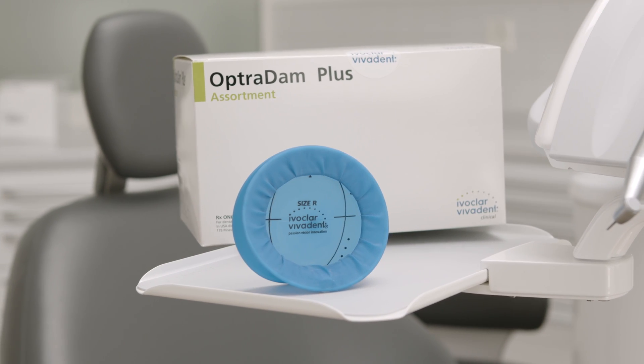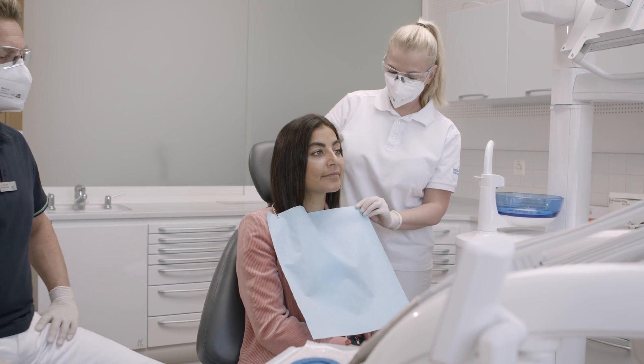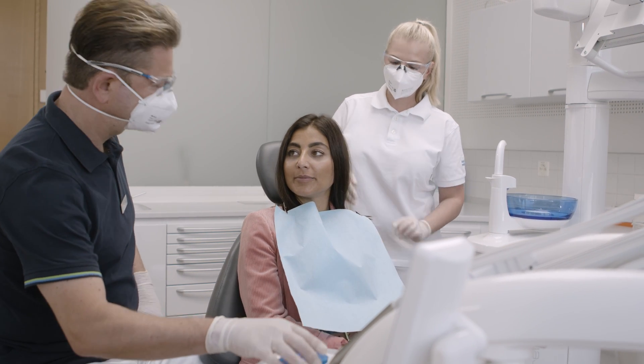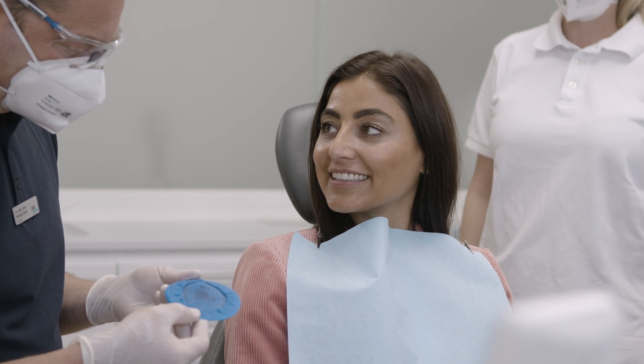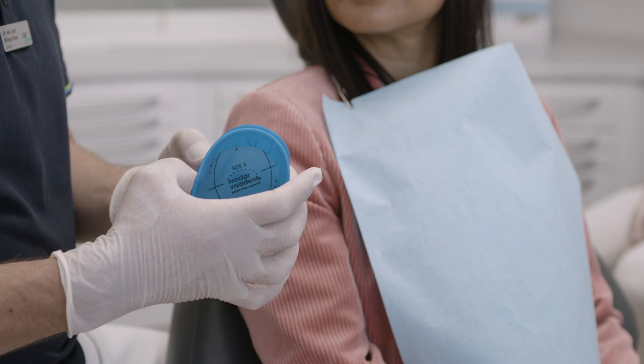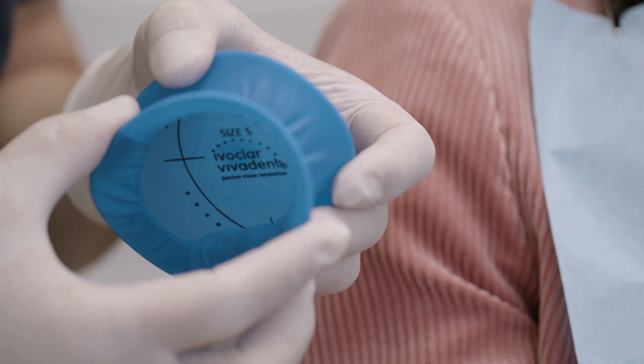Optradam is a three-dimensional rubber dam used for absolute isolation to control the spread of infectious disease and aerosols in the practice. It features high flexibility and elasticity in all directions, provides patient comfort and assists in keeping the patient's mouth open.